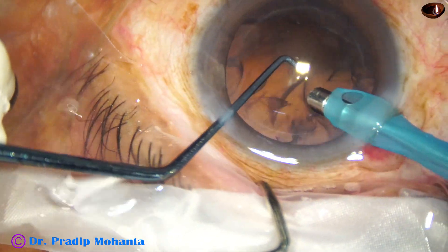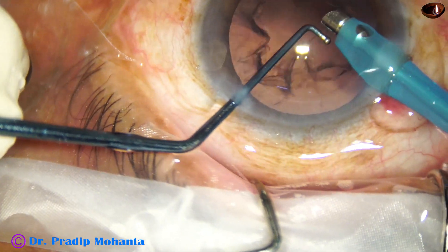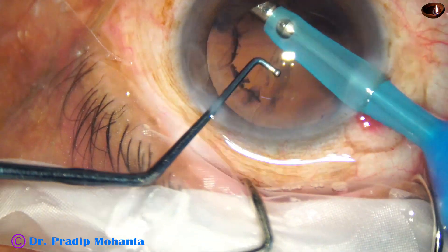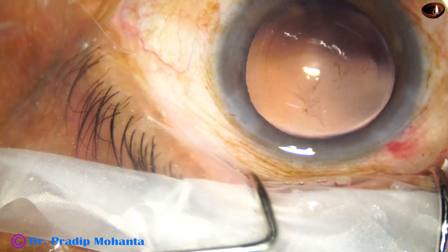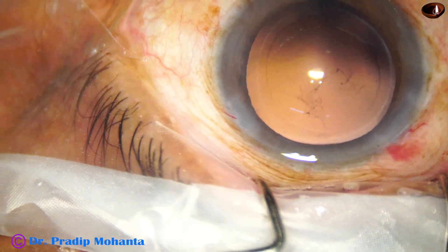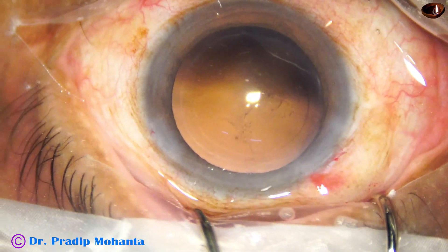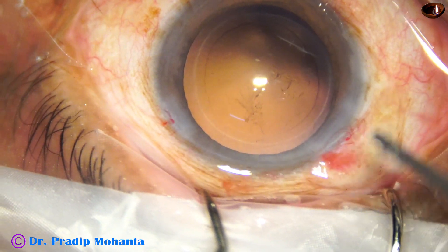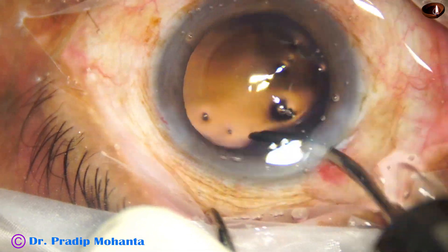We have to be very careful not to catch the posterior capsule. Even if we catch it, we must have the reflex to stop and release by reflux. We must develop the reflex to stop and release the posterior capsule using reflux.